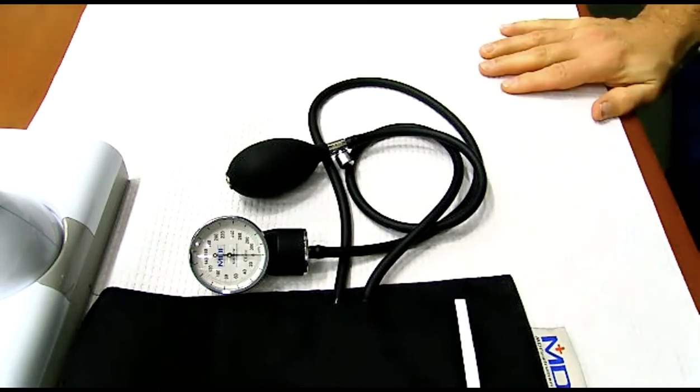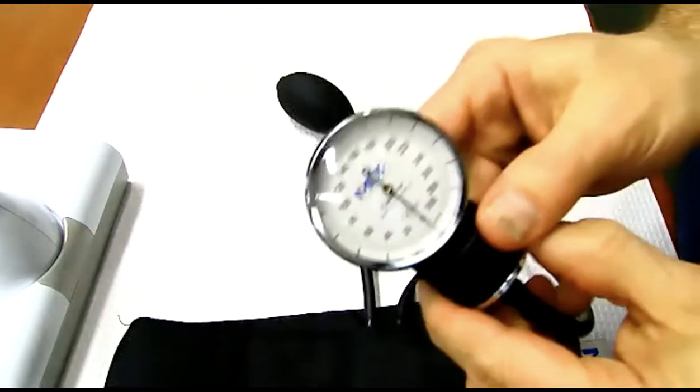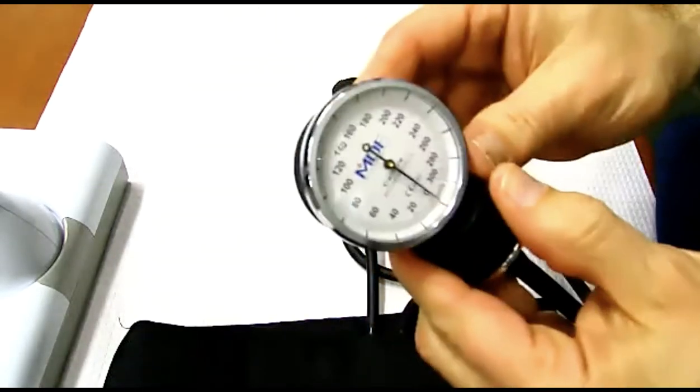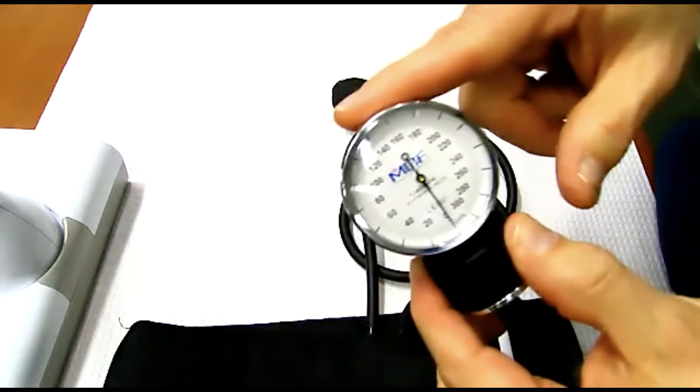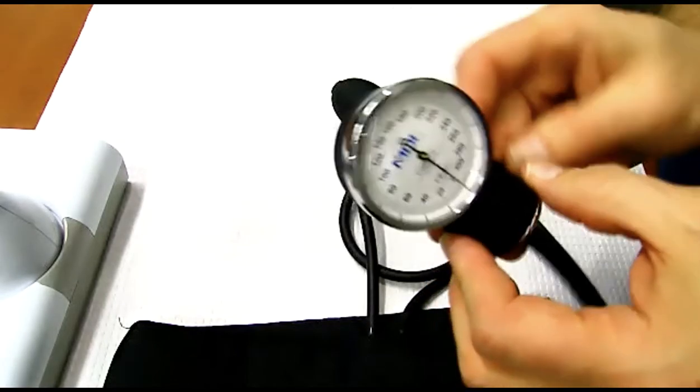So let's talk about the pieces and the parts. Let's start with the manometer to begin with. Look at your pressure gauge here. It's pretty straightforward. I would tell you this is the most sensitive piece of the equipment. I know some of you shove things in and out of your backpack. Try not to drop it. Be a little bit gentle with this piece.